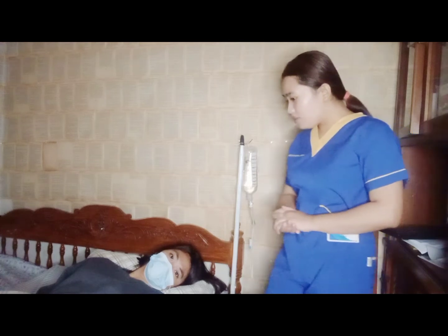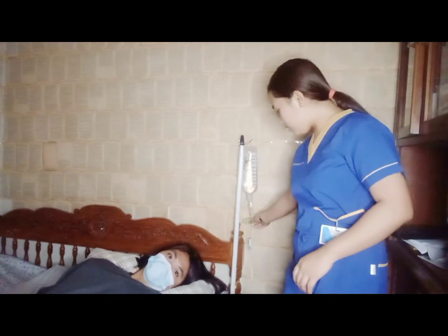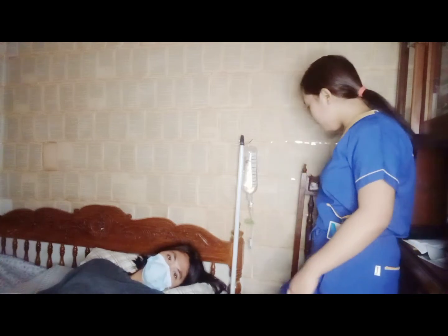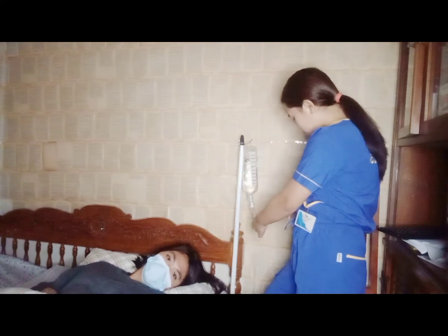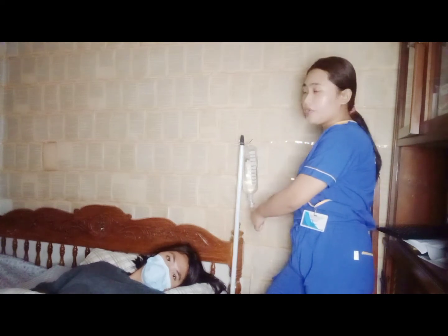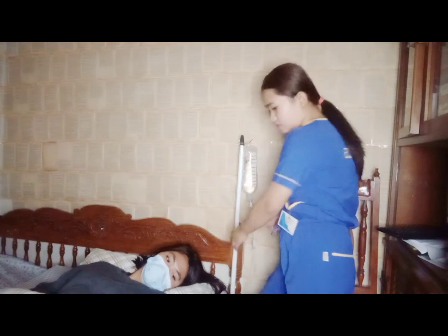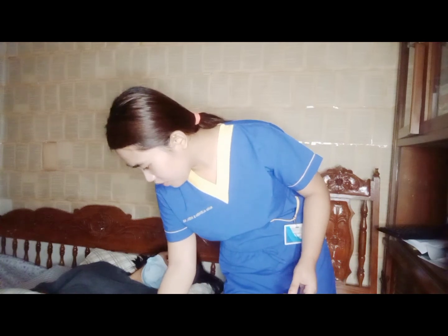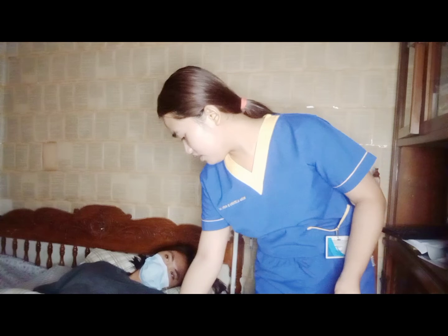So, kamusta ma'am? Kamusta po ang kalagayan ninyo? May masakit ka po bang nararamdaman dyan? Wala naman po, ma'am. Okay, check ko lang po yung flow rate. Okay, so we need to adjust the clamp until we achieve the ordered flow rate of the solution. So, check ko nga po yung kamay ninyo, ma'am. Wala naman po kayong nararamdamang masakit dyan? Wala naman po. Okay, good.